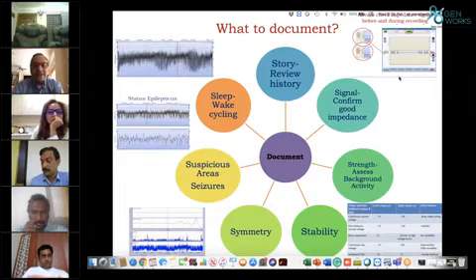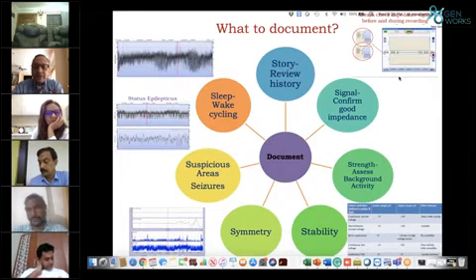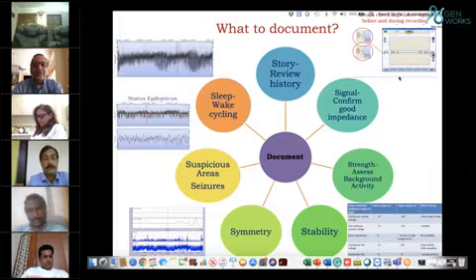There could be several causes of asymmetric traces. Are the leads not well applied? Is there a cephalhematoma on one side? Is there a subgaleal hemorrhage on one side? Or is there intracranial hemorrhage or stroke on one side? So I think asymmetric patterns will point you in a lot of different directions that you need to actually go through.